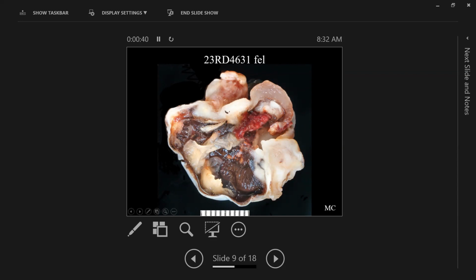So over here, we have probably roughly the limbal sclera, and then another side of the limbus over here, roughly. We can see a bit of conj over here to sort of delineate maybe the approximate area of the conjunctival fornix to help us. There's this sort of gelatinous, almost tan tissue that's bulging forward, and at least a clear defect from here to here. So you might think this could be remaining cornea, but I know differently, and we will see on the histologic section. Then we have no evidence of a lens grossly.